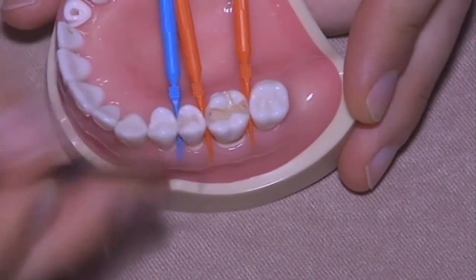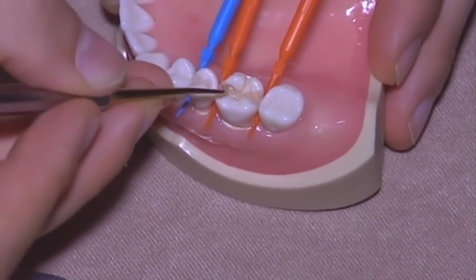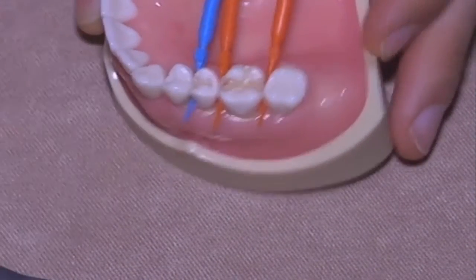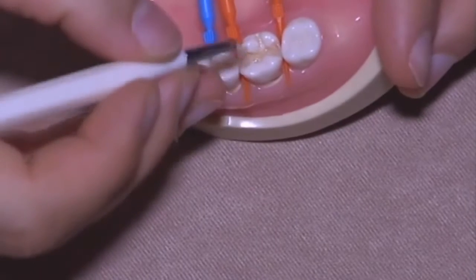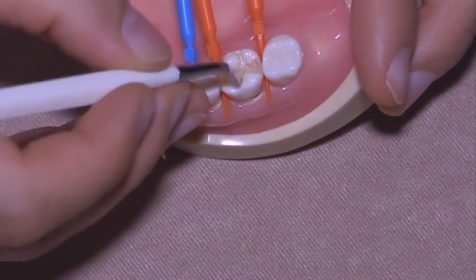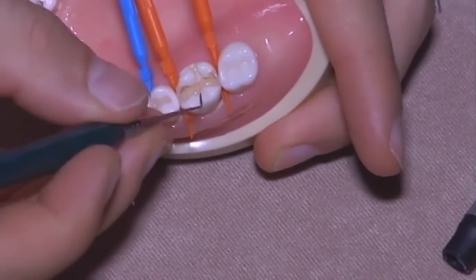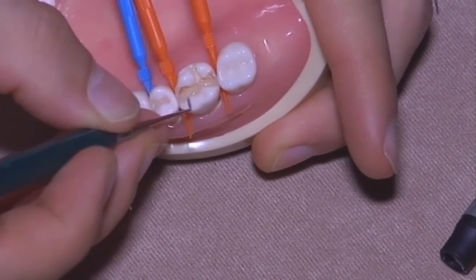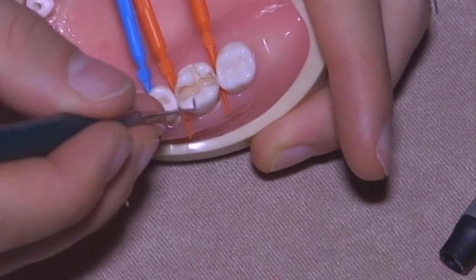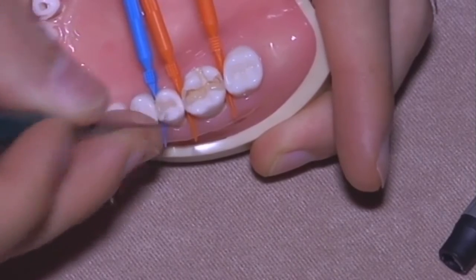So, adaptation. And also in the dentin layer, you start modeling everything, beginning by following the anatomy of the tooth. The anatomy starts from the dentin. The other suggestion is to immediately remove the excess.